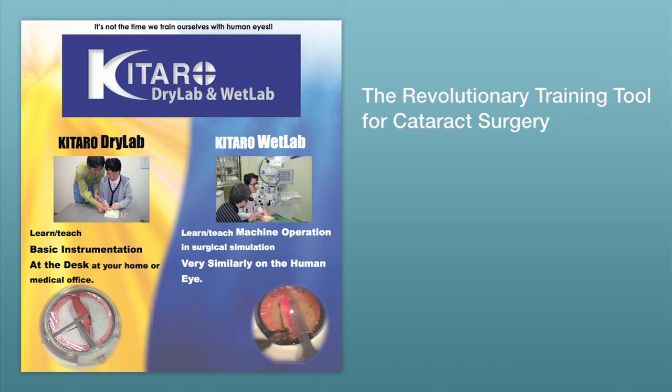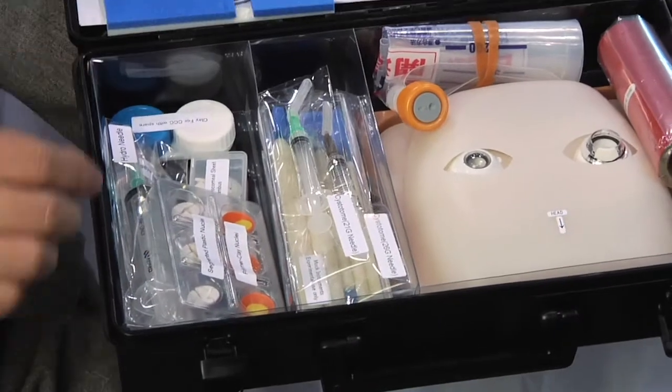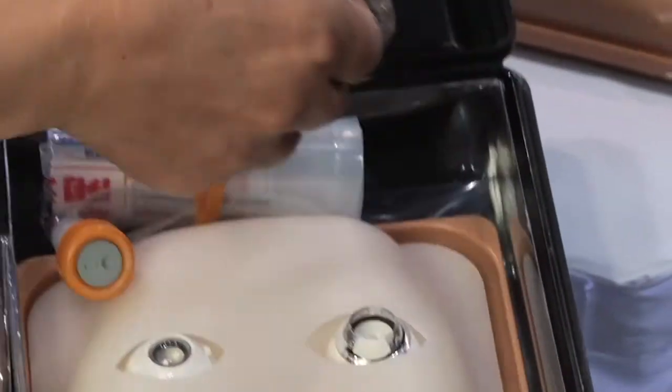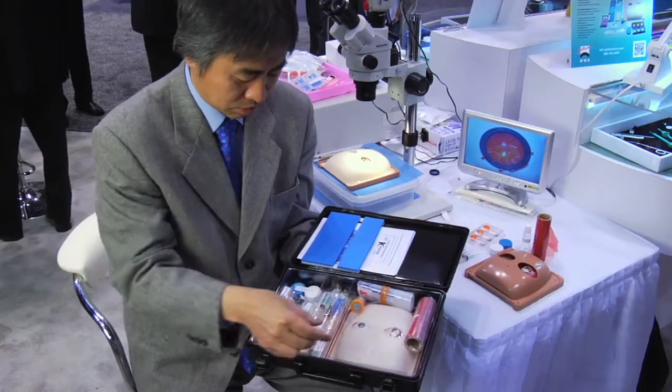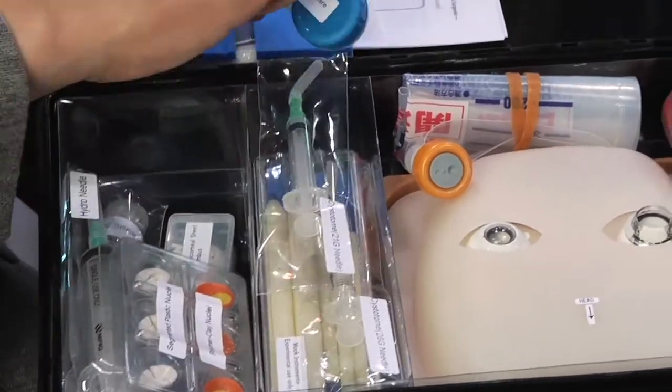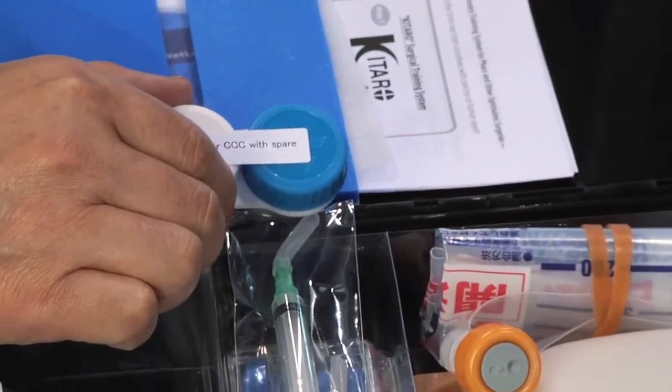In the dry lab, a surgeon can repeatedly practice CCC and nucleus dividing at their desk to master the basic instrumentation before moving on to the wet lab practice. This is the anterior capsule film. This polyester film has a special two-layer structure and is placed over the reusable polymer clay cortex to reproduce the capsulorhexis in a way very similar to the human eye.